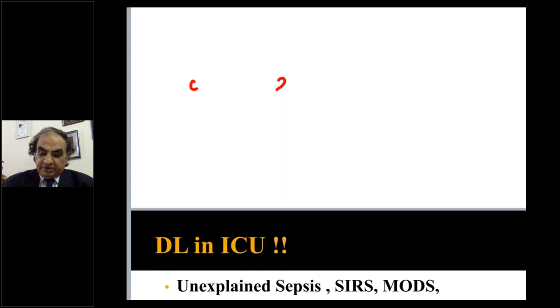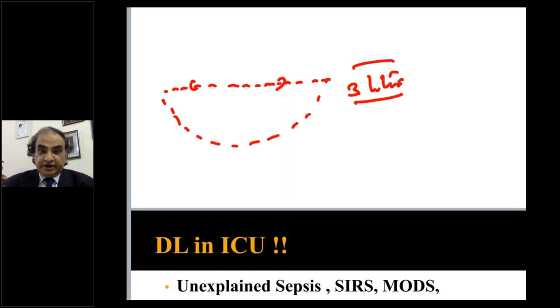If the blood is up to the level of the deep ring, filled, that is about 3 liters, approximately. But if you suck it and put it in the jar, you can measure it anyway. But if you're asked, you should know it. And say if it is half, it's roughly about 1.5 liters. It's a rough estimate. So for those clever guys who want to talk about it, it's a good thing to talk about, okay?